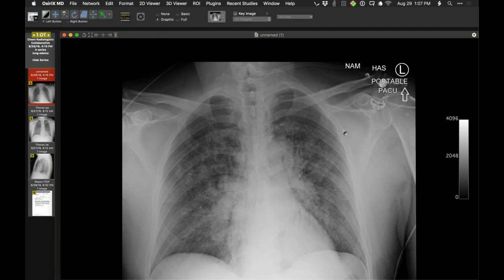On this radiograph, there is actually quite a bit of central parahilar lung alveolar consolidation. I don't know why the distribution is that way in this particular person. In other cases of this that I have, the distribution of the lung edema hasn't been so central or parahilar particularly. In some other cases, there are more findings of interstitial edema. In this patient, there are a peribronchial fluid cuff or two, but otherwise central lung consolidation particularly.